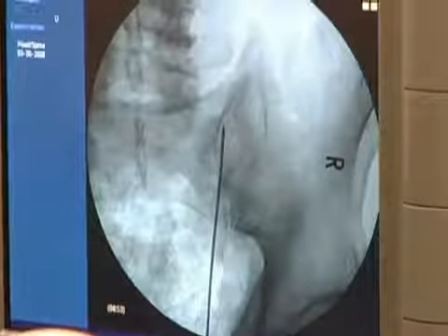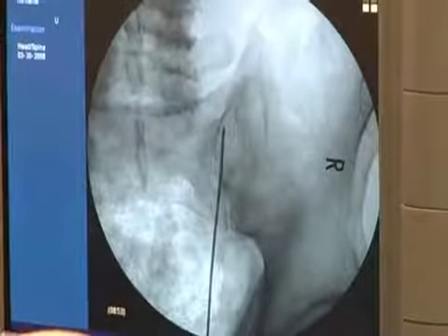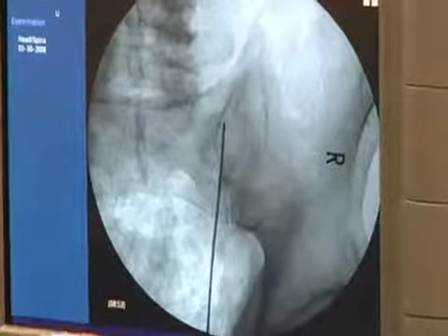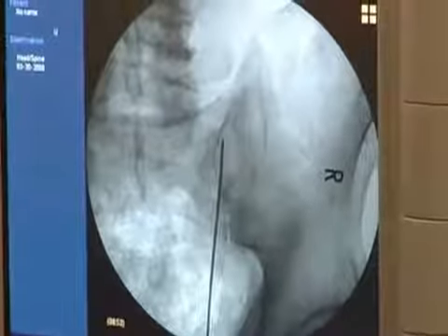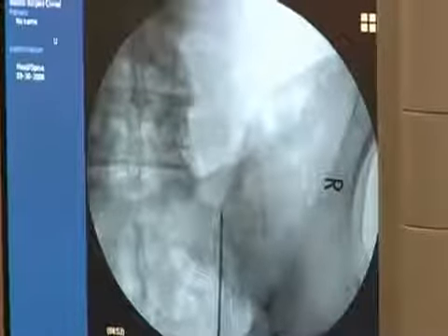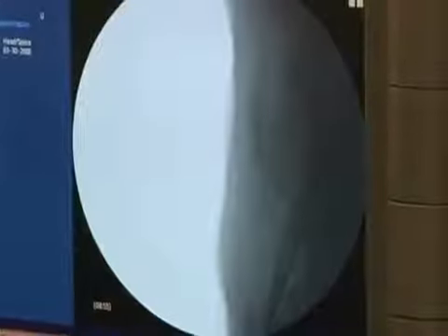You're under the ala there, aren't you? Uh-huh. Yep, I should be. We'll look on the lateral and make sure that we are. So now, let's first go to a square 5-1. Can you put a little marker on the handle, where it will have the Neurotherm name on it, so you know which way it curved? And see if I did this right. So drop down a little bit.